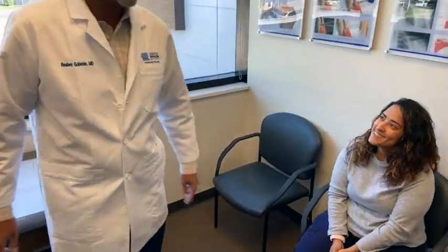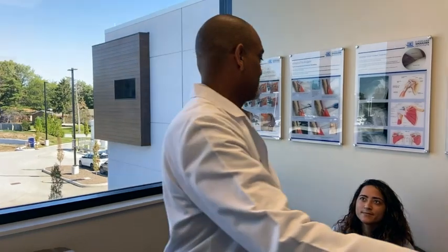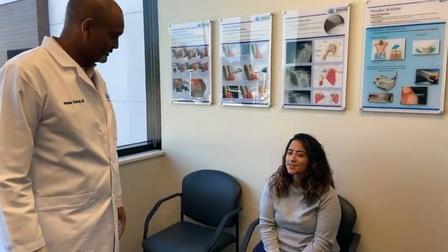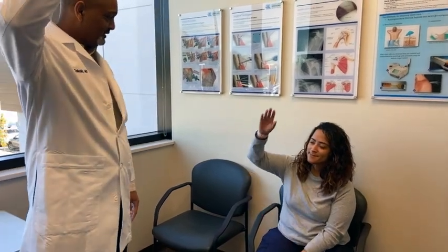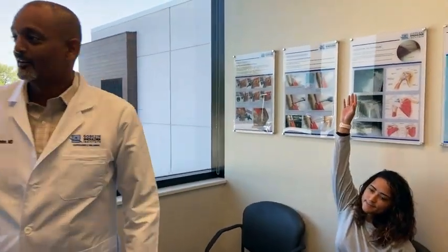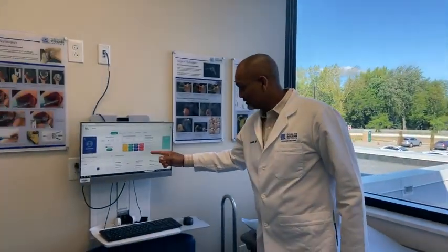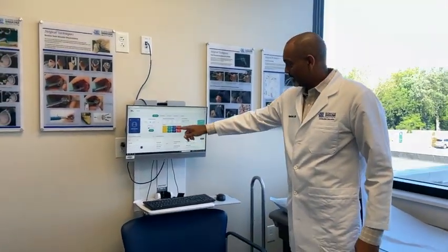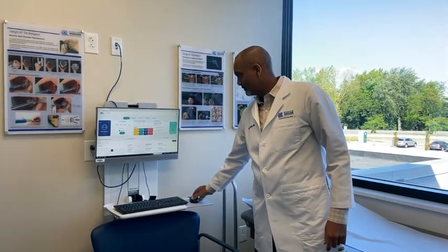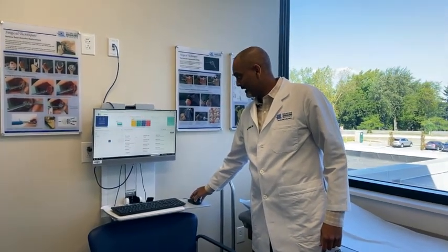You'll see now. Well, hi there, Marion. How are you? Good, how are you? Nice to see you. I see that you're about 6 weeks out from a biceps tenodesis. Yes. Great. How's it coming along? It's been going great. Let me see you raise it. Okay, good. Raise it all the way up, all the way up. There you go. Great. And here I see you've been doing your therapy. Yes. Great. And you're doing green, and the dashboard looks really good. Very compliant. Good job.